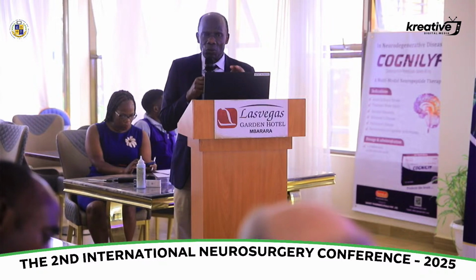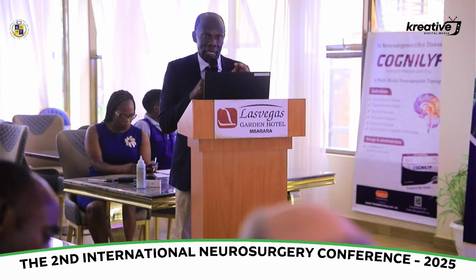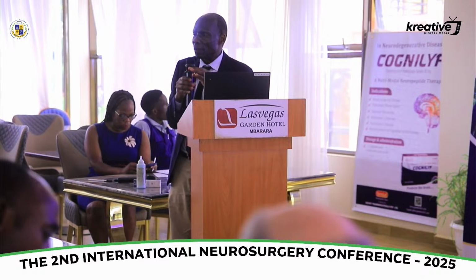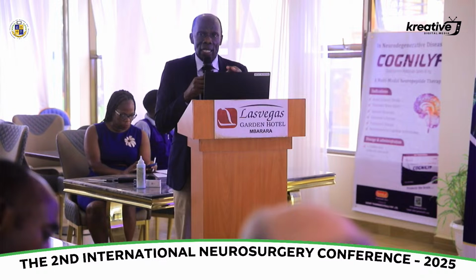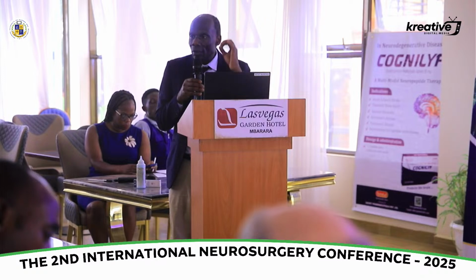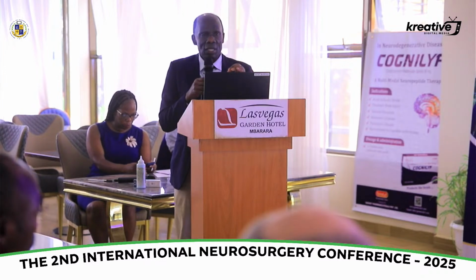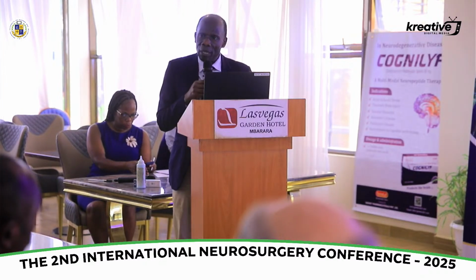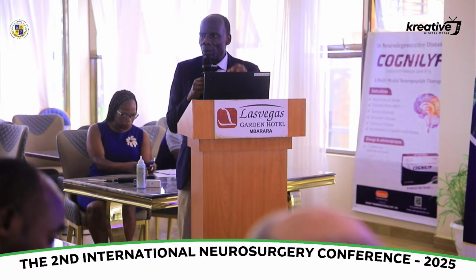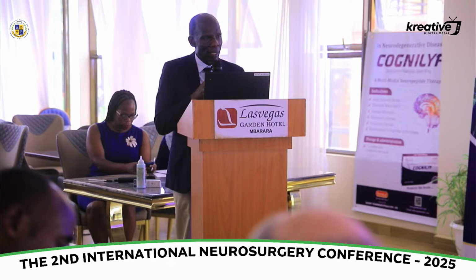It is going to be very useful for us to monitor patients who have got infections, brain abscesses. Today, we treat abscesses by aspiration, and you can't be sure whether there is reaccumulation. And once you have created a window on the skull, then you can use ultrasound to monitor the progress of this condition. So it is not only diagnostic, but also monitoring of our patients as we have them on the ward. So I thank you very much for bringing this skill to us.